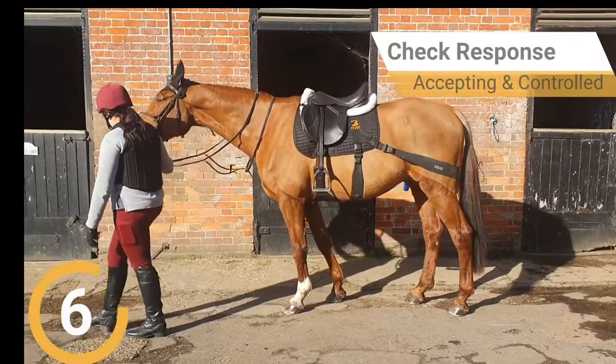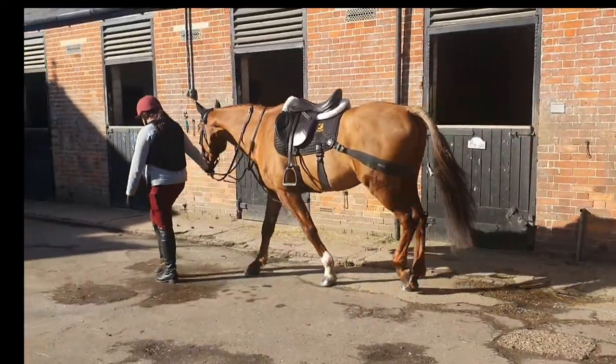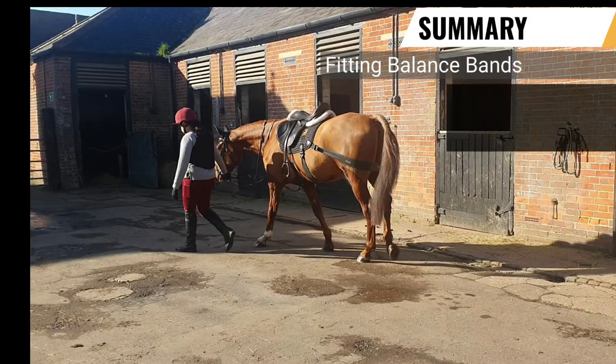Step 6. Ensure that the horse accepts and is comfortable wearing the bands during movement before progressing further. To summarise fitting the balance bands.